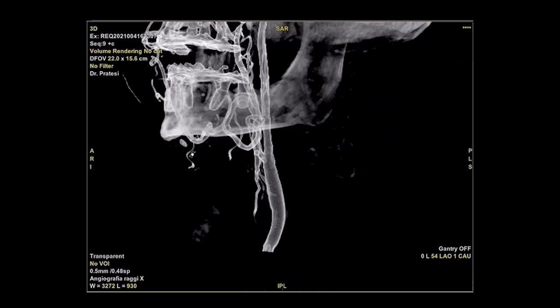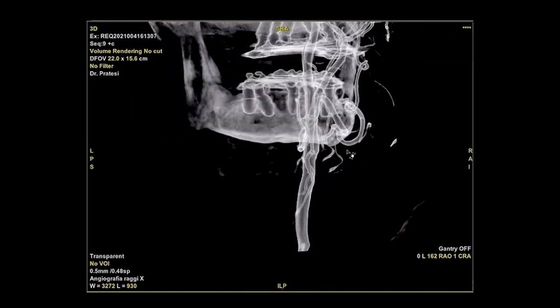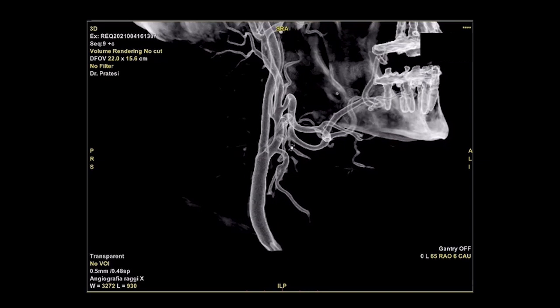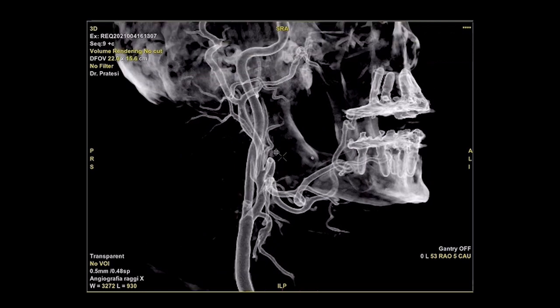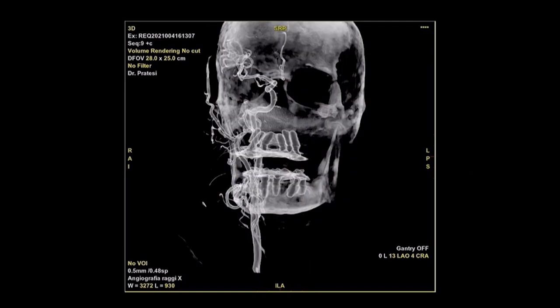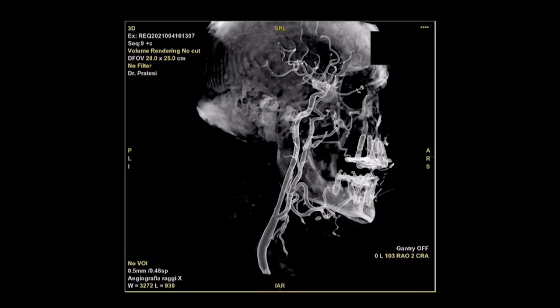You see that now you can reanalyze by rotating the 3D volume rendering reconstruction of your carotid artery, and again, an additional feature that allows you to more appropriately evaluate the results of your procedure, increasing the effectiveness of new imaging techniques, which can now be concentrated and combined in the same machine.